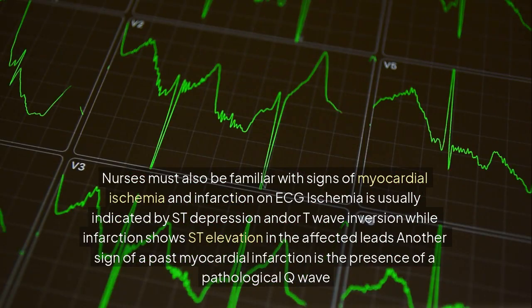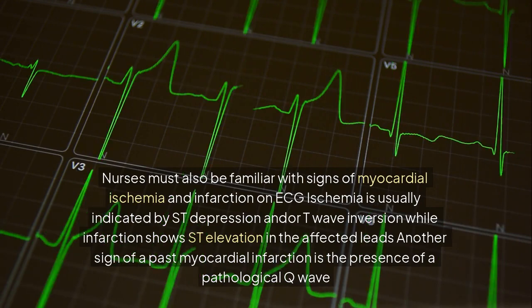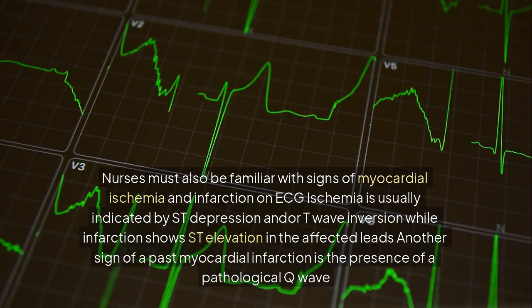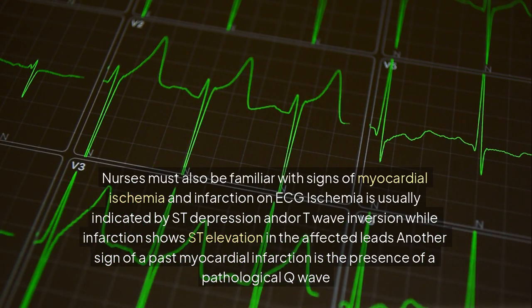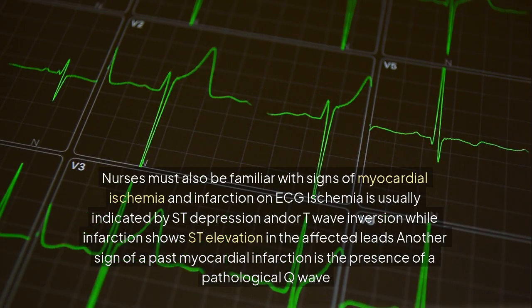Nurses must also be familiar with signs of myocardial ischemia and infarction on ECG. Ischemia is usually indicated by ST depression and/or T-wave inversion, while infarction shows ST elevation in the affected leads. Another sign of a past myocardial infarction is the presence of a pathological Q wave.